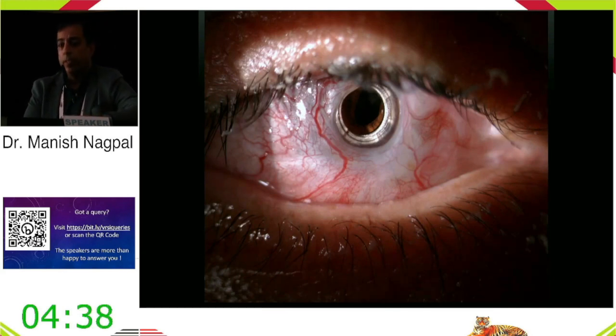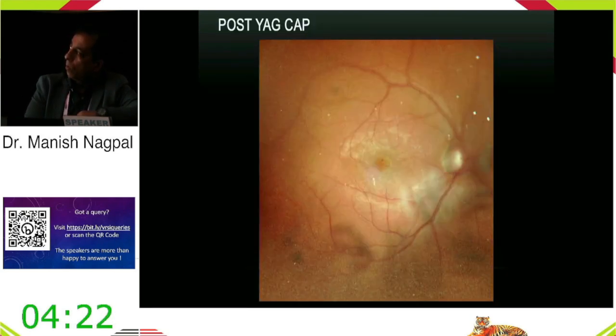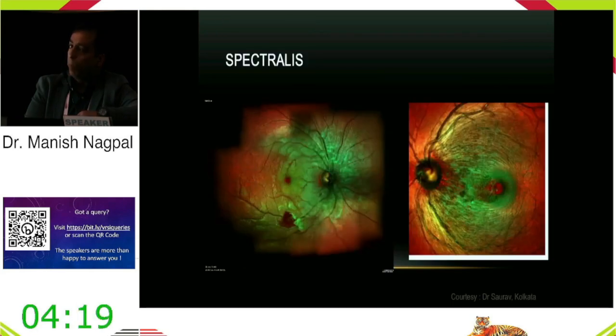Also keratoprosthesis. We had a patient some time back who had come with a decrease in vision with a keratoprosthesis, and we were struggling to see the fundus, but we could get these images quite reasonably well with the Mirante. You can see the cystoid edema which was there, and then we gave a Kenacort to the patient and it improved.